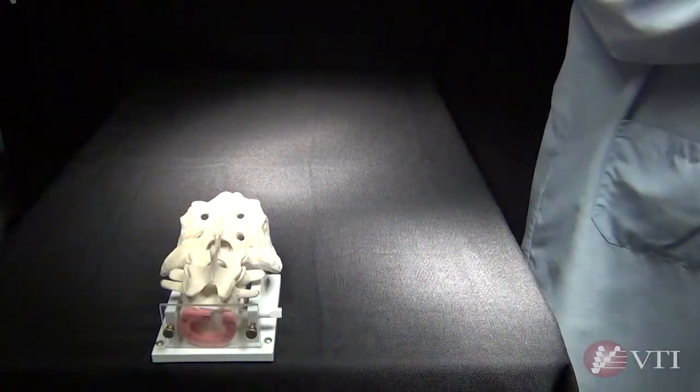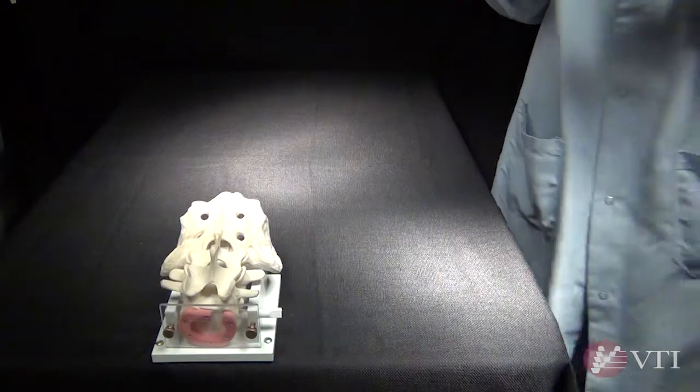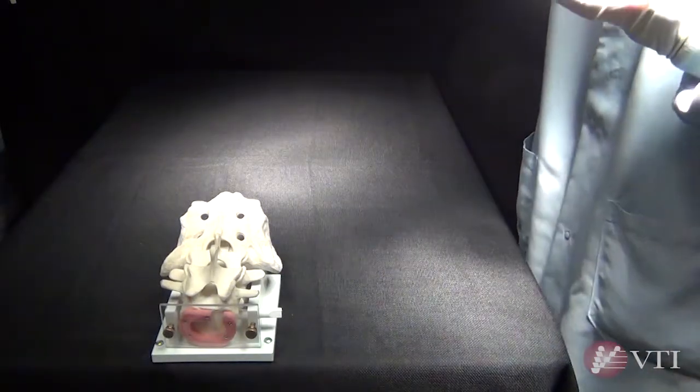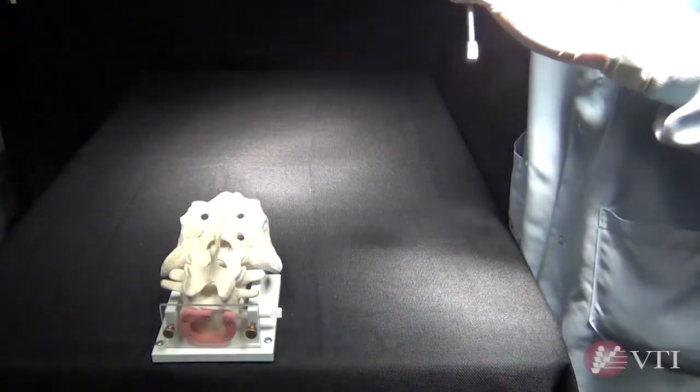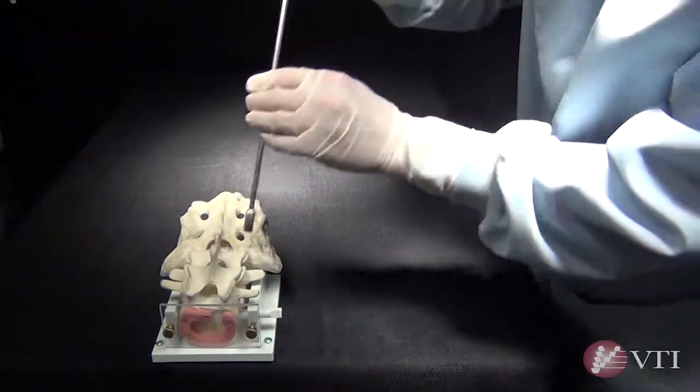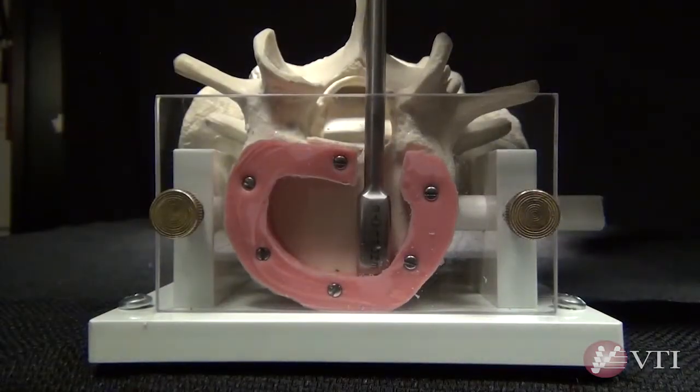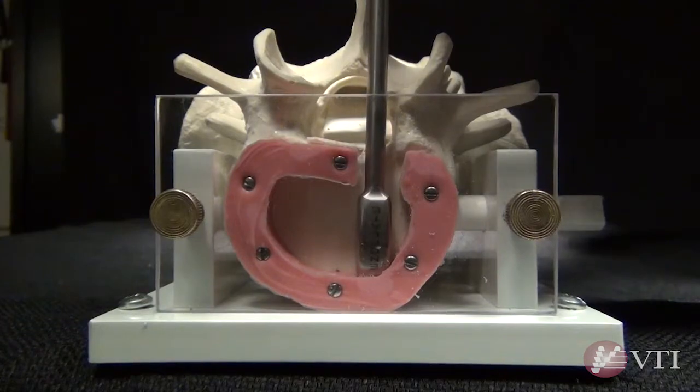Interfuse device height and AP length chosen preoperatively should be confirmed using the device sizers supplied. Final height selection is determined when the sizer appears to fit securely in the disc space but does not require the use of the slap hammer for removal.